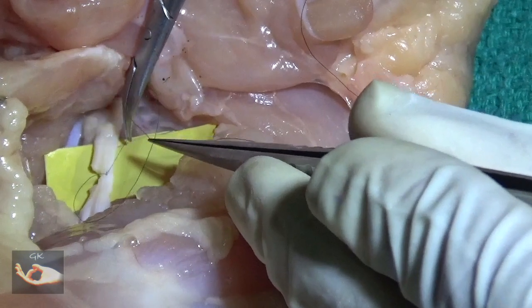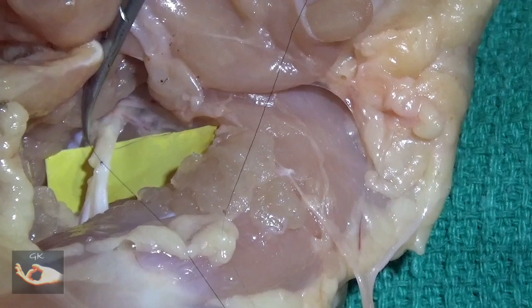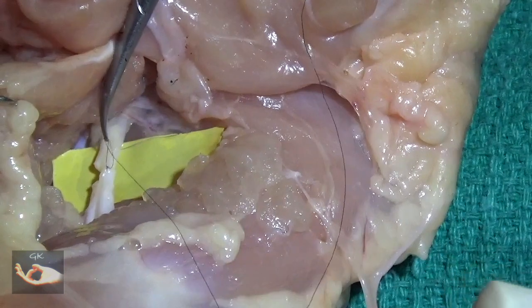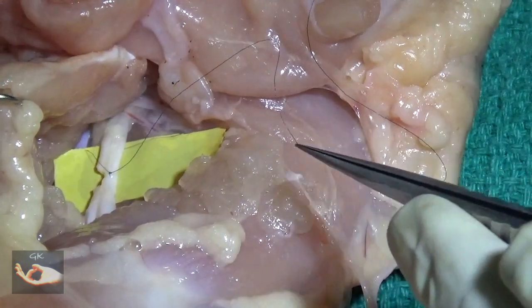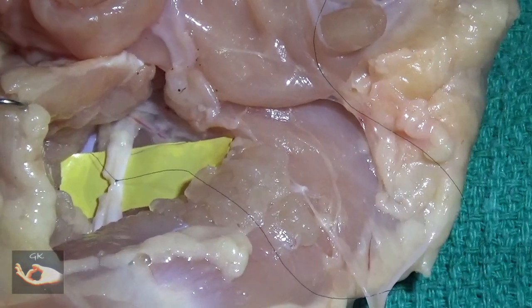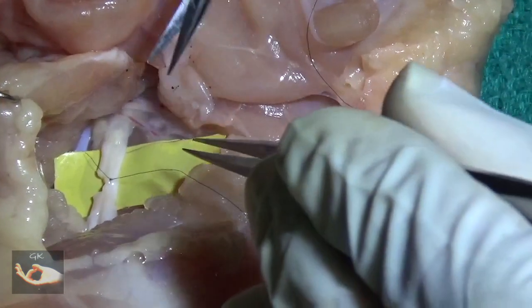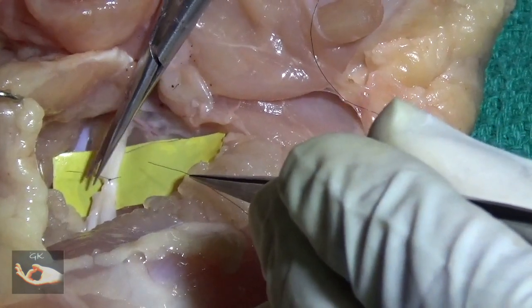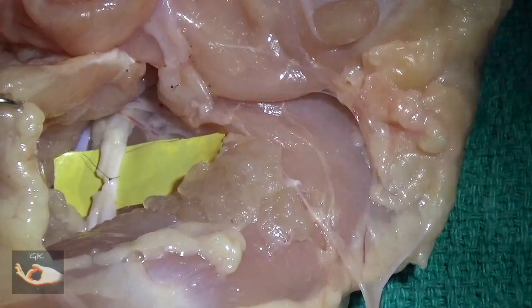It is the difference in tension on the epineurium that causes a pouting of the fascicles. Some surgeons even advise that you do not tie the knots immediately — just leave the threads long, put in all the sutures, and then tie them one by one, making sure that the tension is equal between all the knots. One end is cut close; the other end is left a little long to hold as a traction suture.